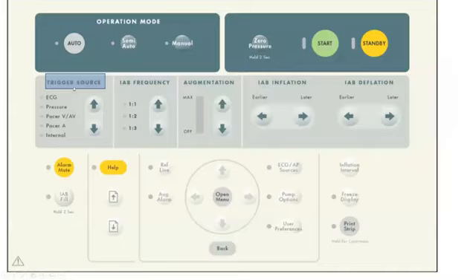So I mentioned that the balloon pump uses EKG to trigger. It inflates at the end of T, remember that? And it deflates at the peak of R. Peak of R is isovolumic contraction. You need to know that. However, it can use other triggers that are not advised.